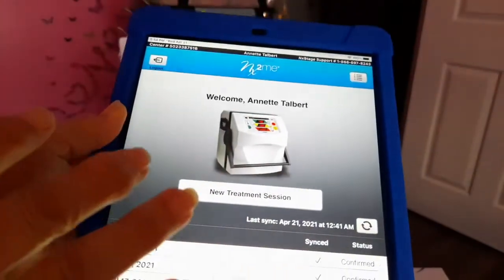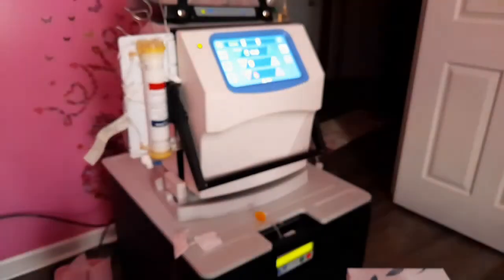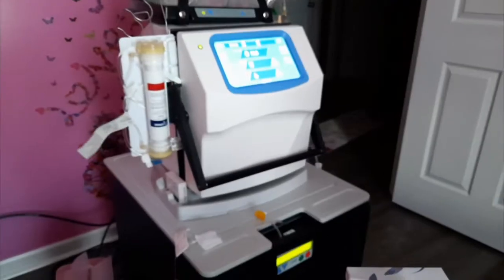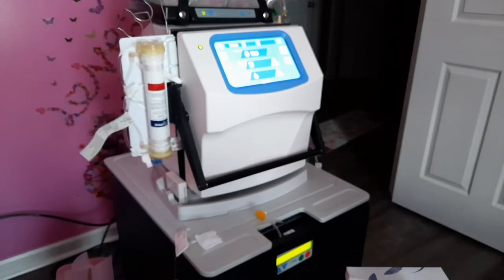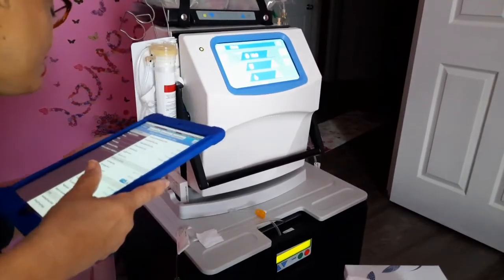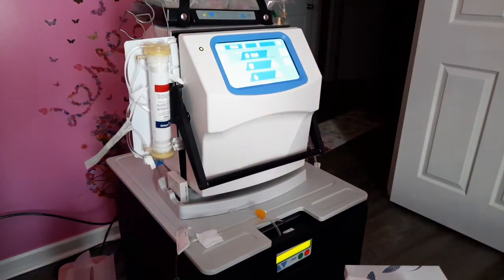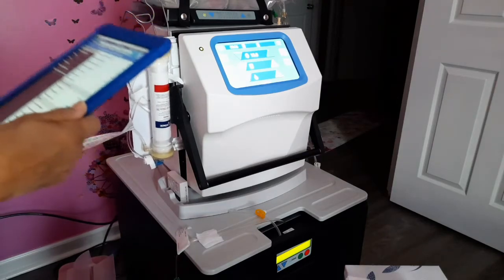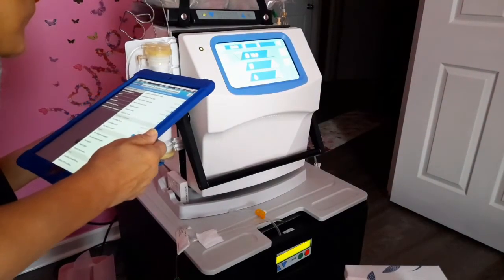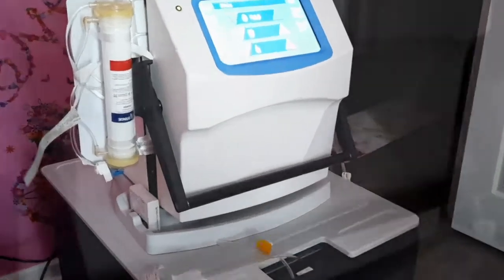Okay, so I'm signed in. And this is using Wi-Fi. Go to the new treatment session, and I'm getting ready to put in all my information. So, I verify the cartridge type is cartridge 170C. It's usually on the tag. Cartridge 170C, right on this tag right here. So I verified that. And then the lot number. 77027 on the last five. 77027.